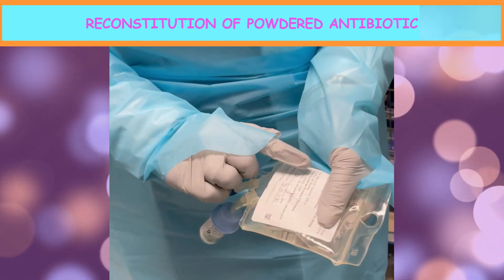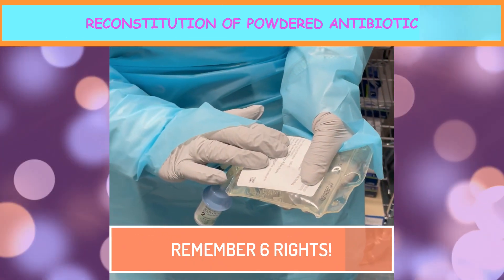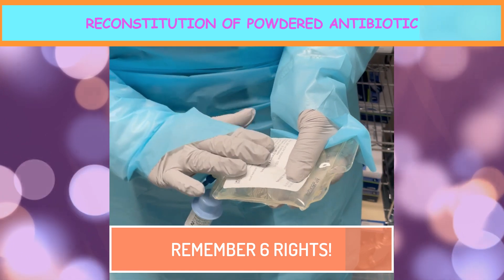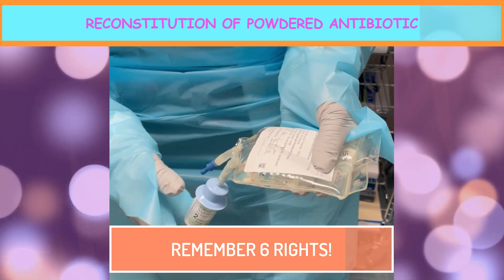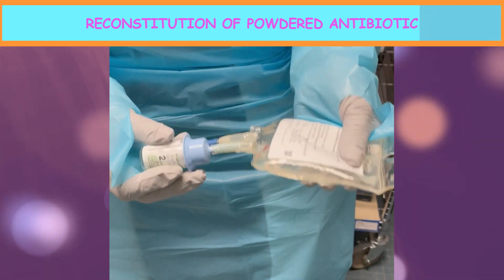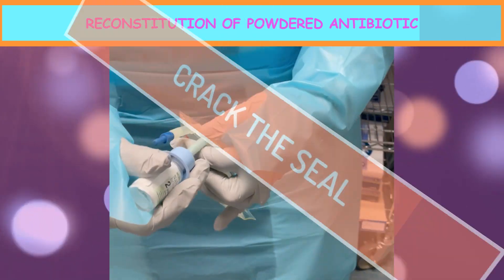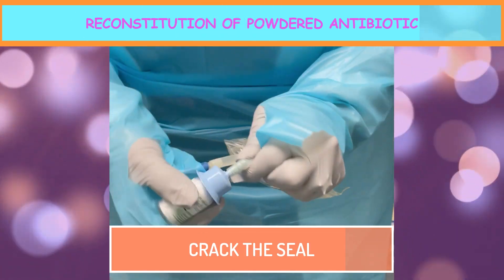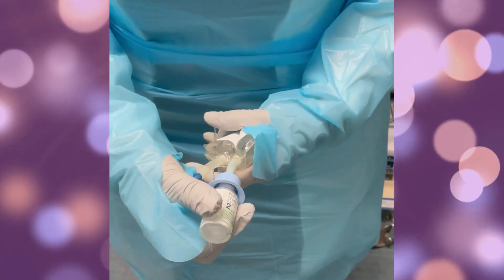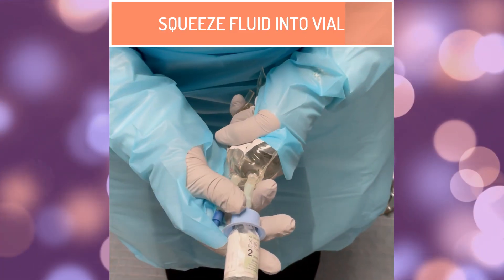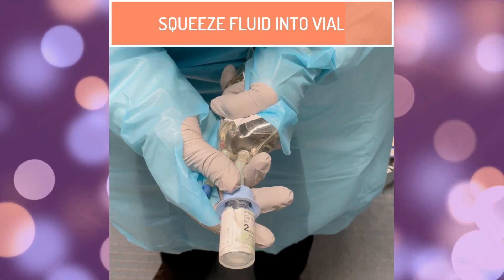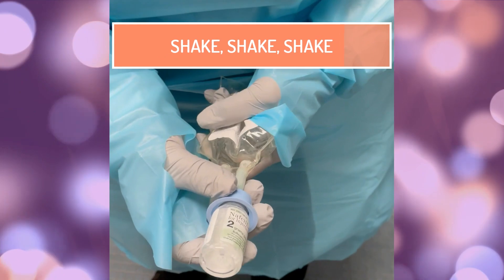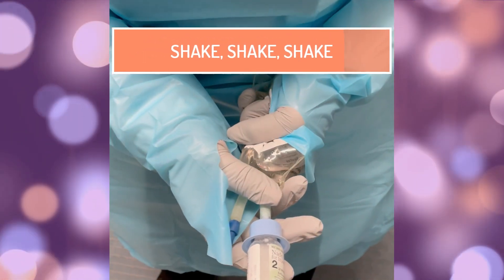Then we always want to make sure that we have the right patient, the right dose, and all of the information pertinent to this medication administration. So once those things are checked, you're going to crack the seal. You're going to squeeze some of this fluid into the vial, and then you're going to shake it until it has dissolved.